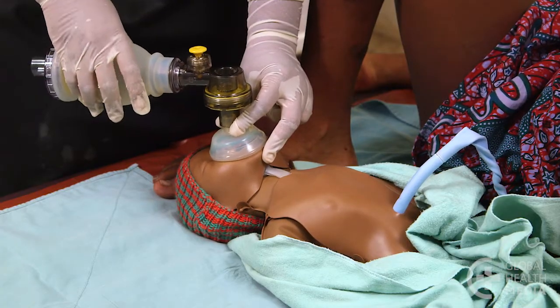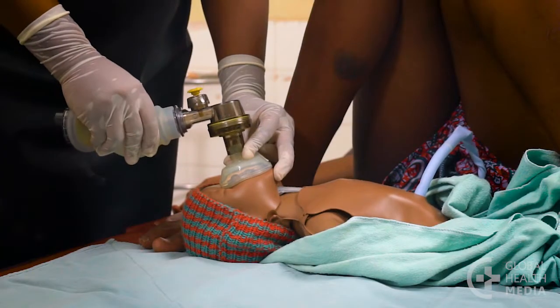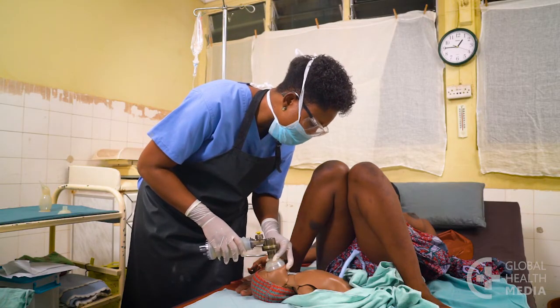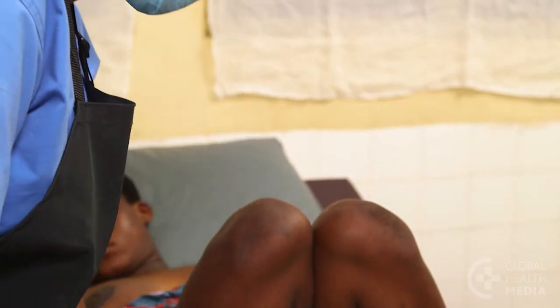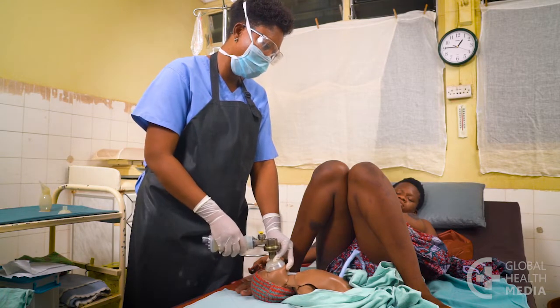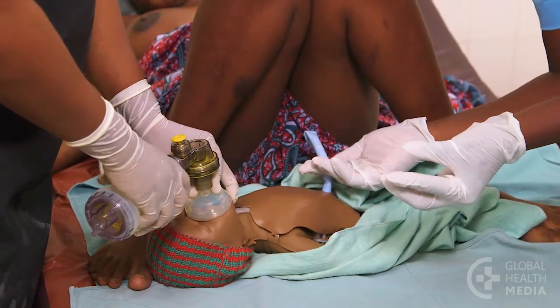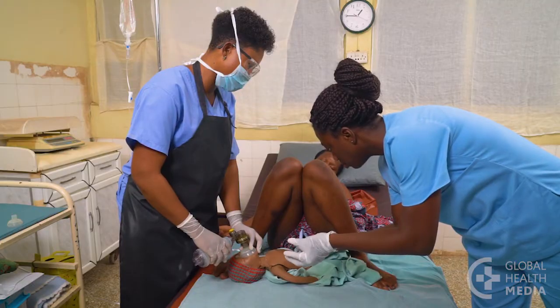Squeeze the bag on 'breathe' and release the bag on 'two, three.' Continue: breathe two, three. Then keep the mask in place while you quickly observe — the baby is still not breathing. Call for help and continue giving breaths: 'Please come in and help me, my baby is still not breathing.' Your helper quickly checks the heart rate by feeling the cord pulse. The baby's heart rate is faster than your own, so it's normal and ventilations are adequate.